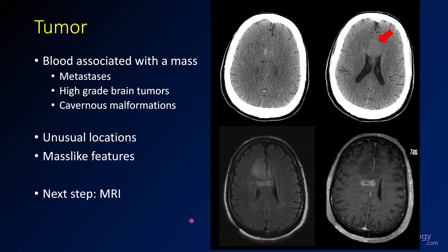Next, tumor. If you see mass effect out of proportion to the extent of hemorrhage, consider whether there's an underlying mass. In this patient the non-contrast CT shows a little hemorrhage along the anterior cingulate, but there's a larger region of expansion crossing the midline. On MRI FLAIR there's expansion of the cingulate crossing the corpus callosum, and there's an abnormal area of enhancement in the corpus callosum — this turned out to be a high-grade glioma. Anytime you see associated mass effect, think about metastasis, high-grade tumor, or cavernous malformation. These patients will frequently require MRI to determine the cause.